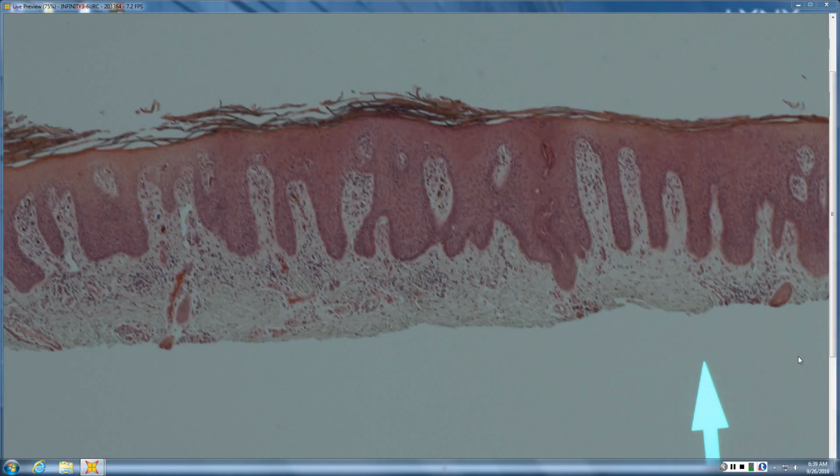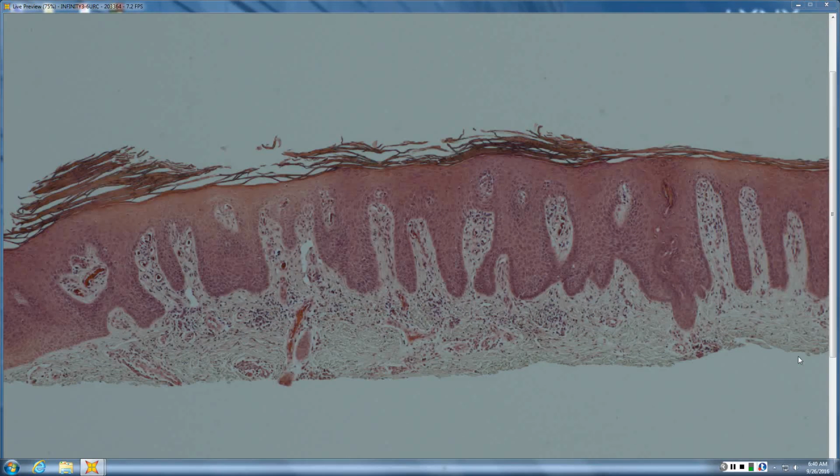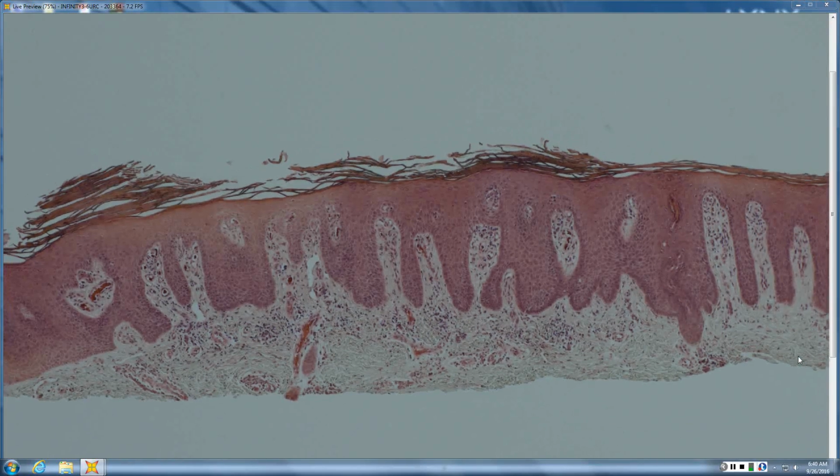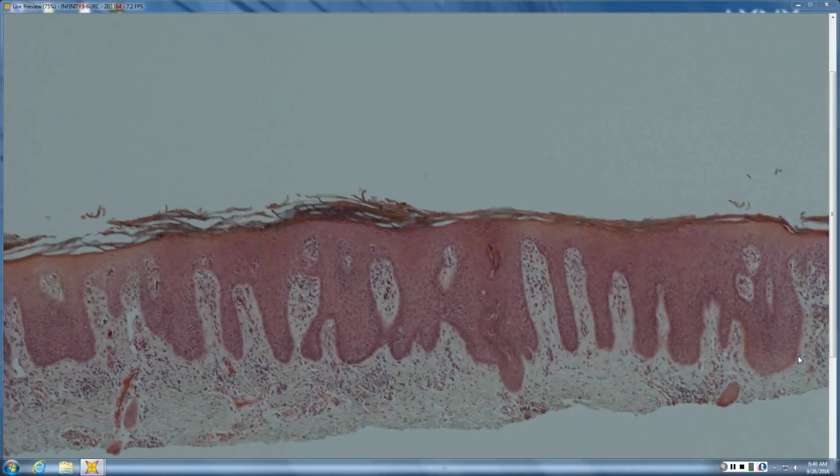Okay, so go through these unknowns. The first one is just prototypical psoriasis. Now it's not perfect psoriasis, but as many staff have said, if you were to actually get a biopsy, so if you do derm path, you don't really see classic psoriasis, because classic psoriasis clinically you don't really need a biopsy because it's so classic.